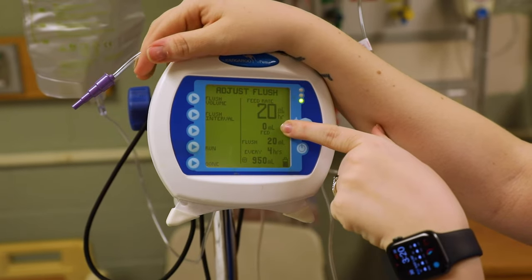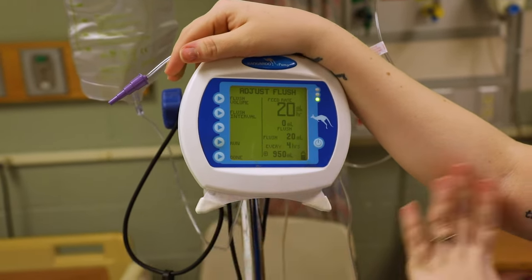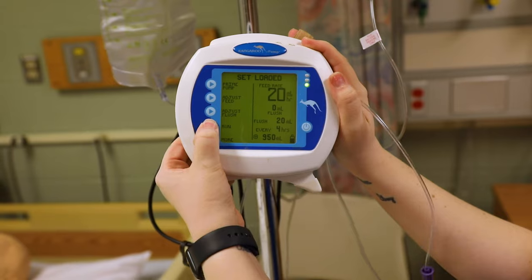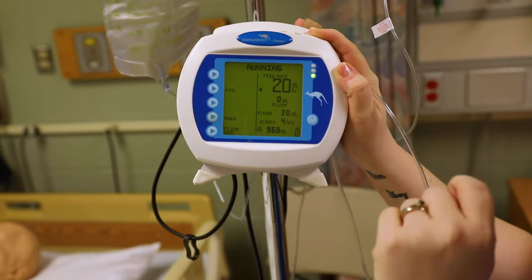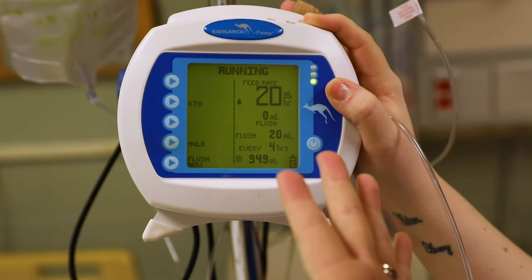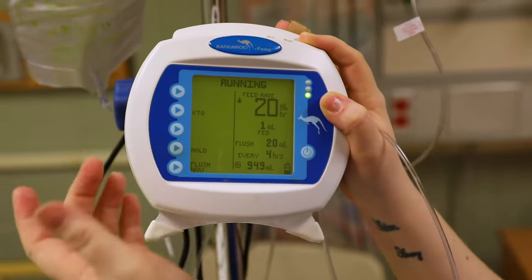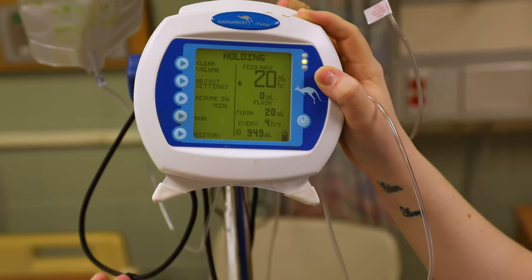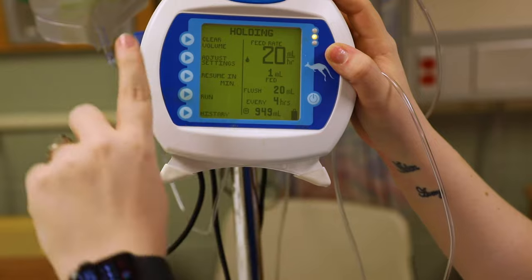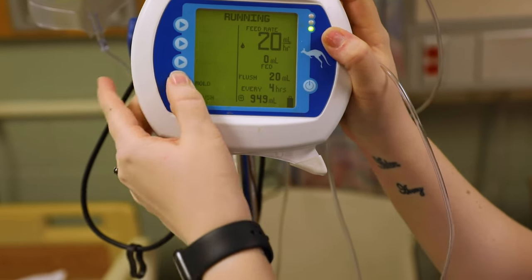Up here there's something that flashes — it says 'Fed,' and next it will say 'Flush.' That's your running counter for intake and output. Once you've verified all settings are correct, connect this to your patient and click 'Run.' You can see it says 'Running,' and the fed counter shows one ml. To get your intake and output for the shift, click 'Hold' and it says 'Clear Volume' — note what was fed and what was flushed, then click clear. It's now reset and ready for the next shift.